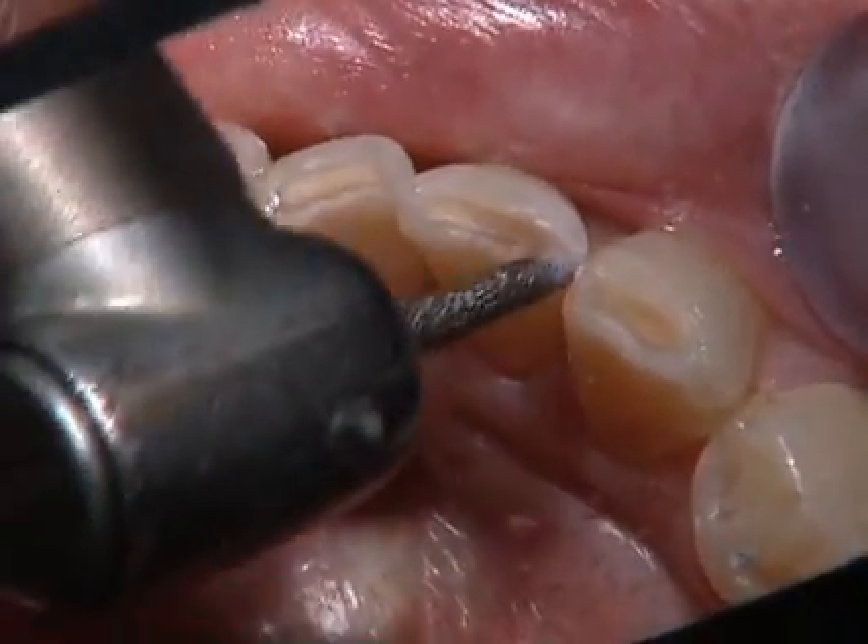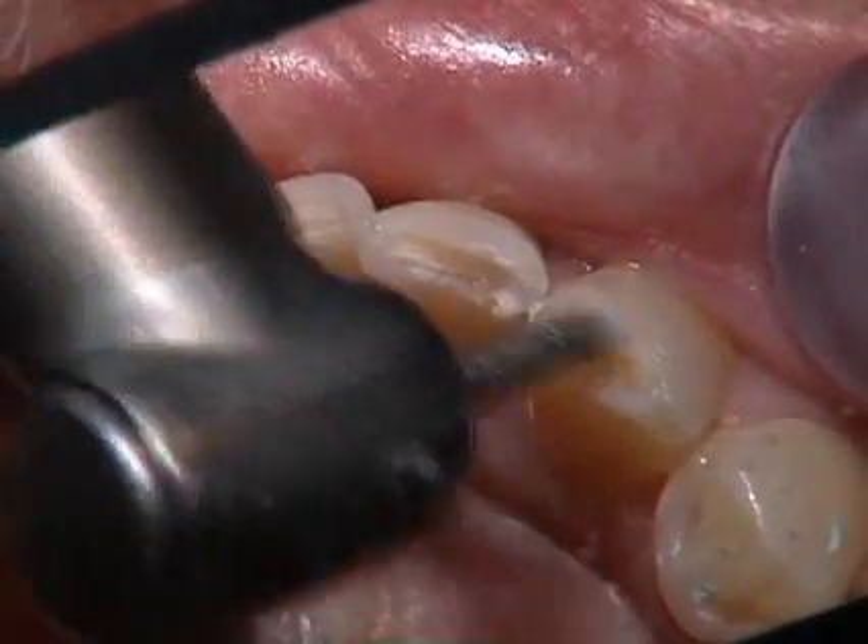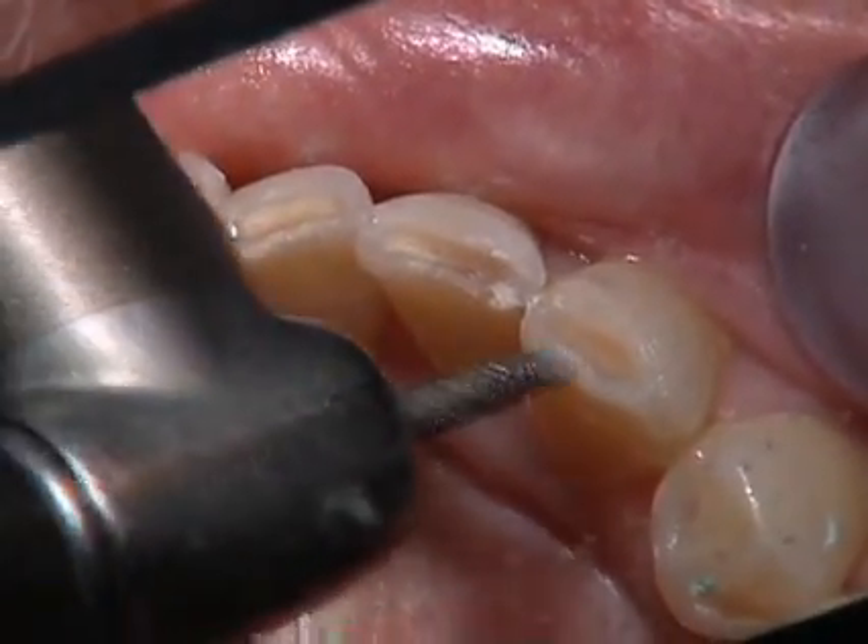Because these teeth have a nice, tight proximal contact and one composite is going to run to the other, we're going to build these separately. We'll start at number 22, then work our way over to number 23.